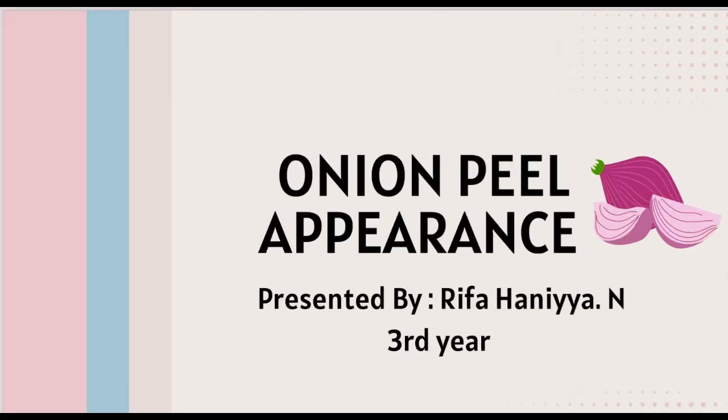Good morning. Today I'm here to present about onion peel appearance. So what is onion peel appearance? It is basically the appearance on a radiograph in which a specific pattern is seen in certain bone lesions. This is characterized by layers of periosteal new bone formation. These could resemble the concentric layers of an onion.